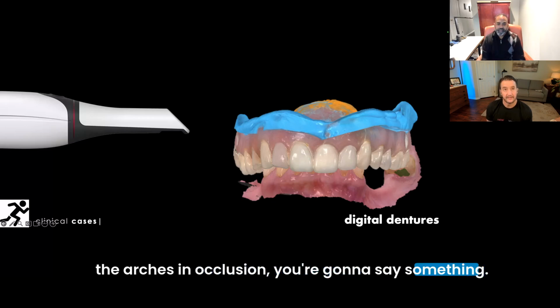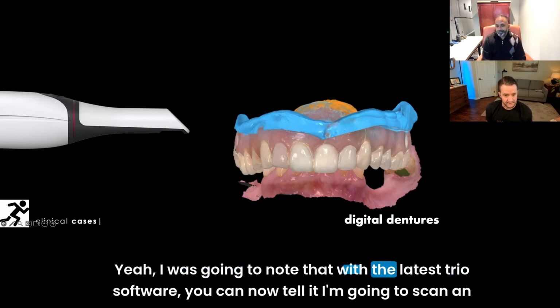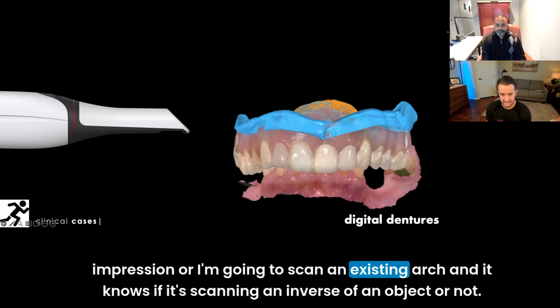You're going to say something. Yeah, I was going to note that with the latest TRIOS software, you can now tell it I'm going to scan an impression or I'm going to scan an existing arch, and it knows if it's scanning an inverse of an object or not. Exactly.